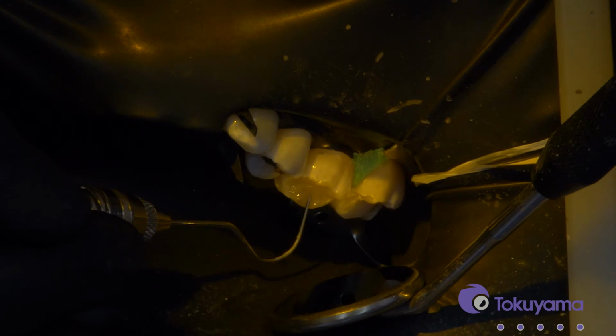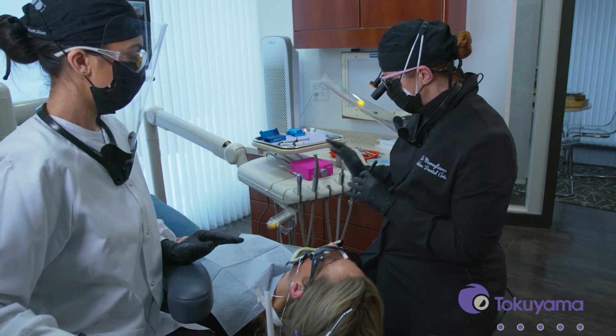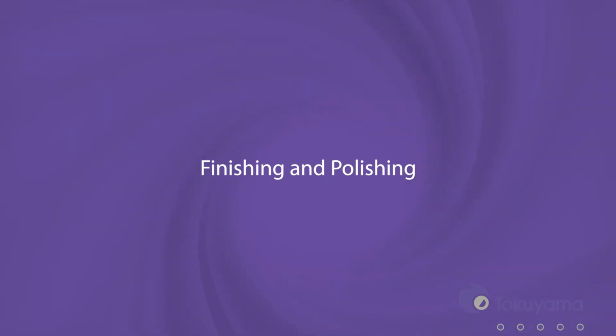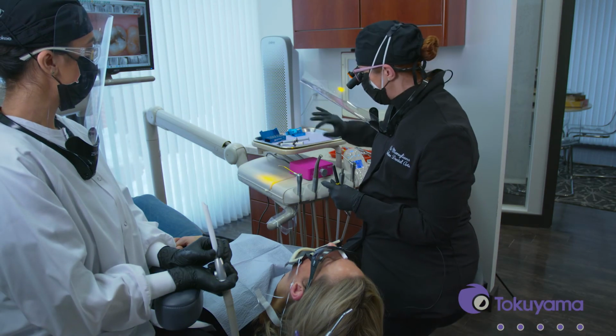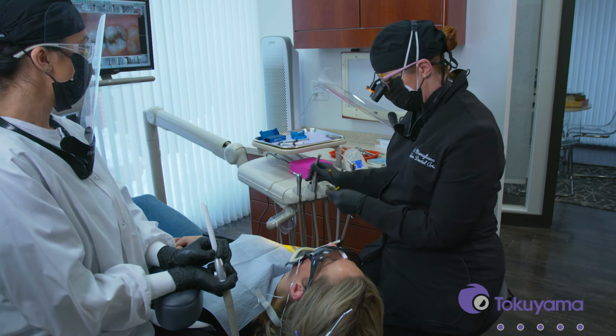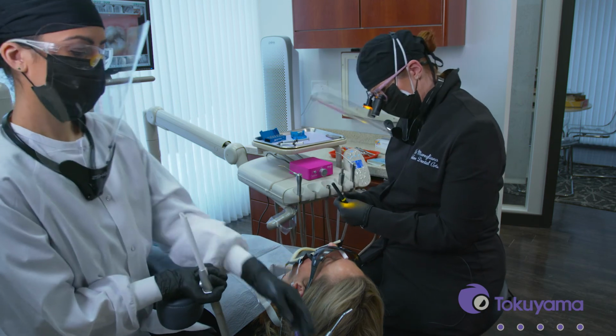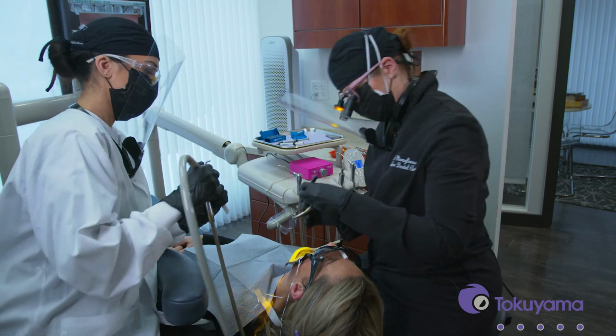Great. Beautiful margins, nice and well sealed. And I think we've got a pretty good match here. Excellent. So now what we need to do is just finish and polish our restoration. It is a composite, so you use your favorite finishing burrs and your favorite polishing burrs. For me, my favorite finisher is the occlusinator. It helps me create really beautiful occlusal anatomy. So we're going to start the finishing process, then we'll remove the rubber dam, check occlusion, finalize it, and then polish. Here we go.